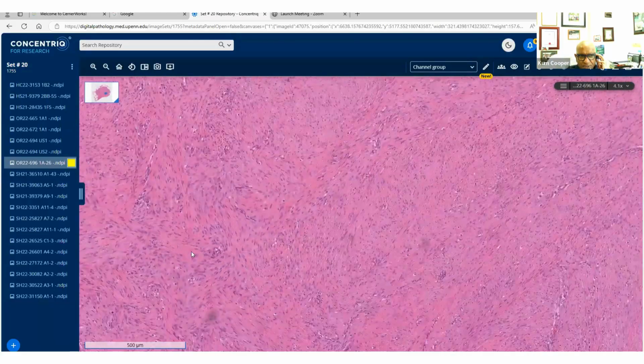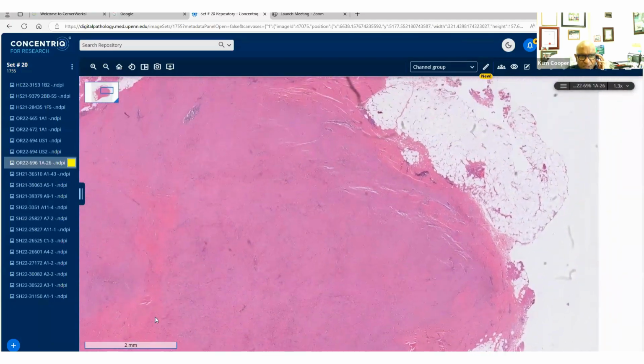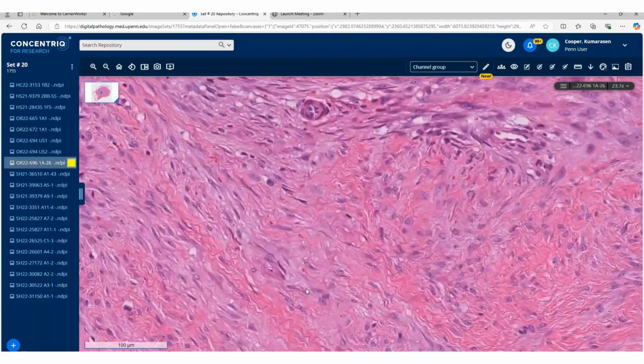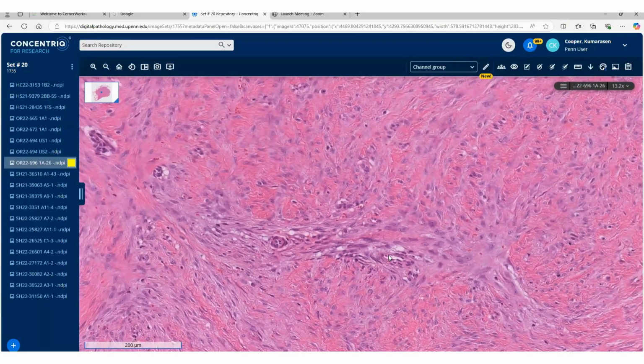Okay. Let's go and find some for you, Dr. Who, Tom Who, that's Tom Who. Yeah, is this enough for your perivascular edema? For me, honestly, yes. It's the little delicate bubbles that kind of surround most of these vessels.